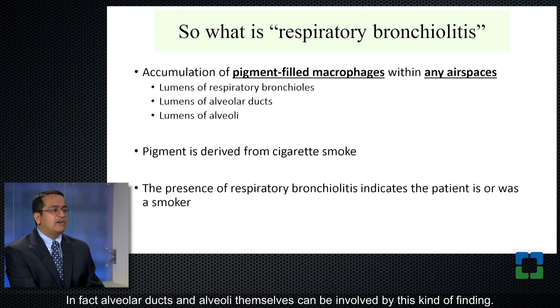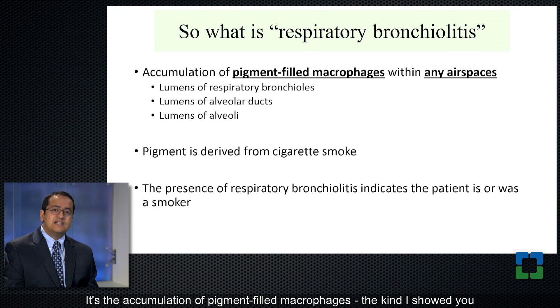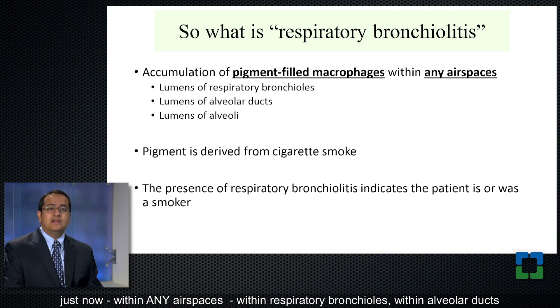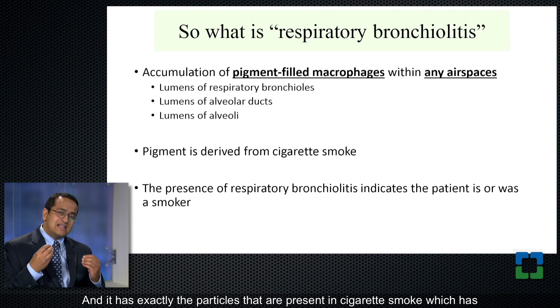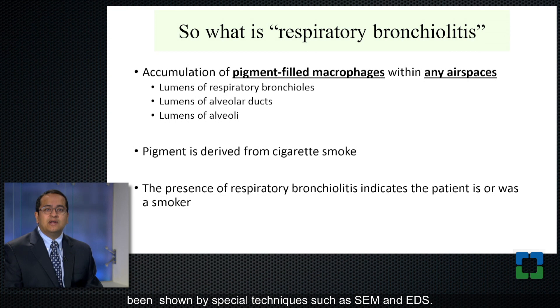What really is respiratory bronchiolitis? It's the accumulation of pigment-filled macrophages within any airspaces — within respiratory bronchioles, alveolar ducts, or within alveoli. They should be in the lumen, not in the interstitium. This pigment is very special because it is derived from cigarette smoke, and it has exactly the particles present in cigarette smoke, which has been shown by special techniques such as SEMEDS.